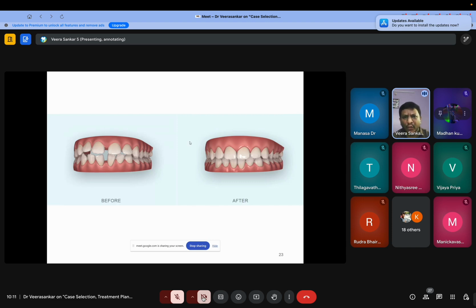Number 2, however, this is only 60 to 70% accurate. After our treatment plan, you should rely only on the treatment plan which was provided from the lab, because this is only AI-induced. So that plan will be more accurate. Also, it shows us how many aligners are required to achieve that particular treatment.